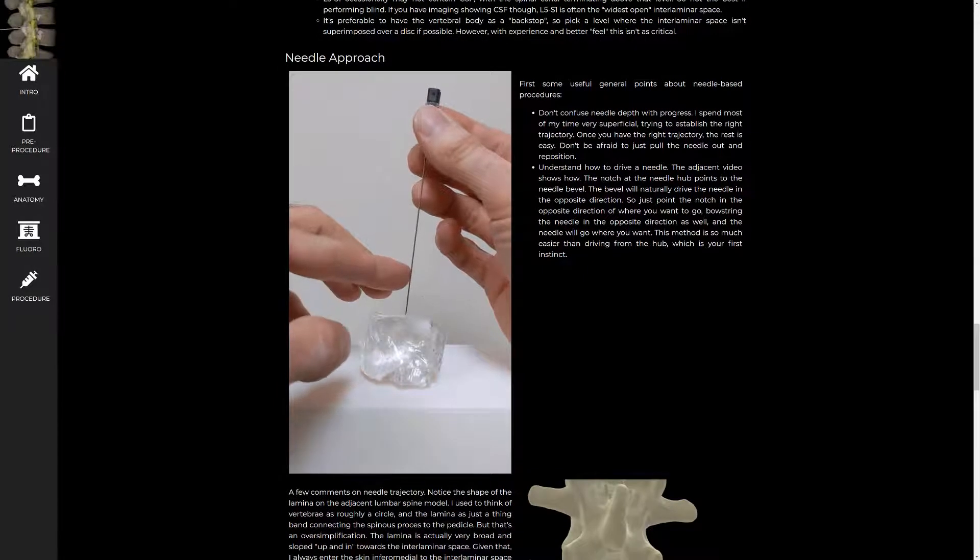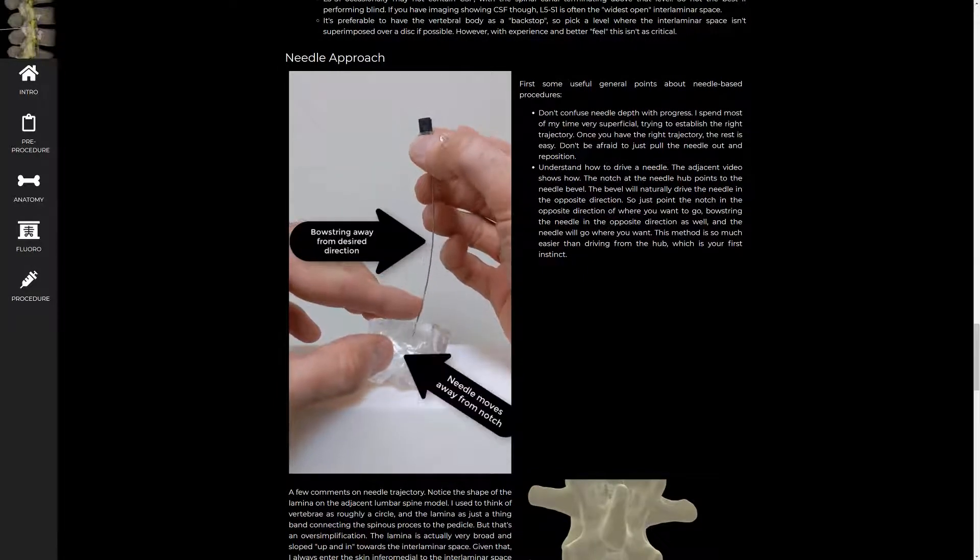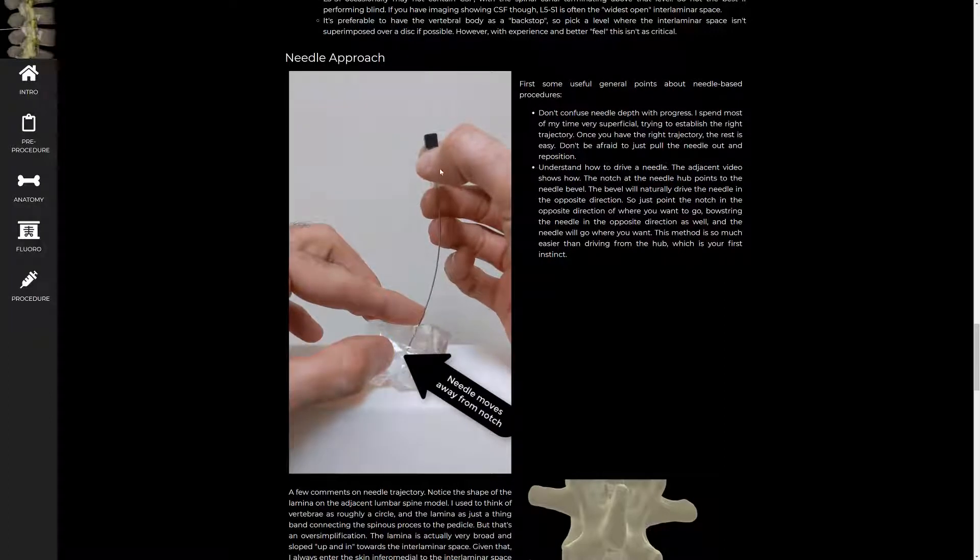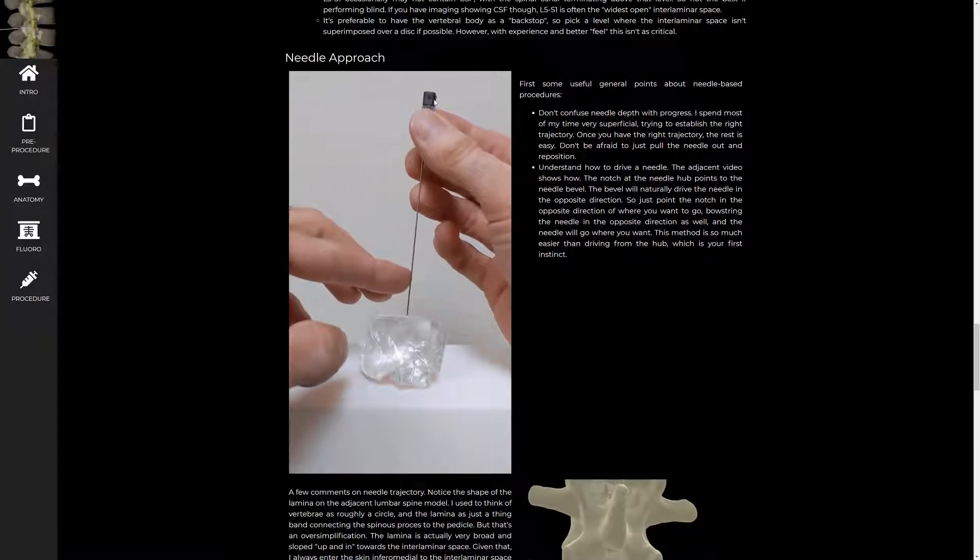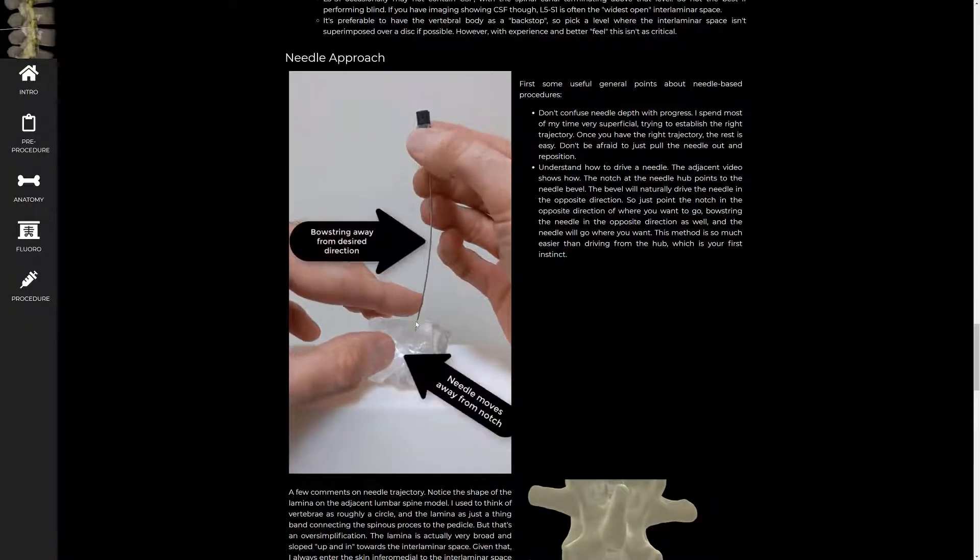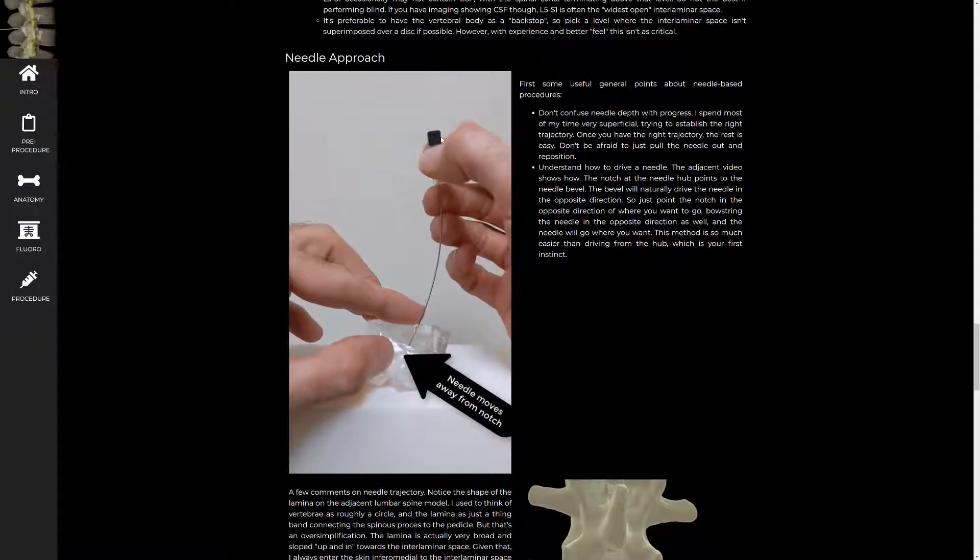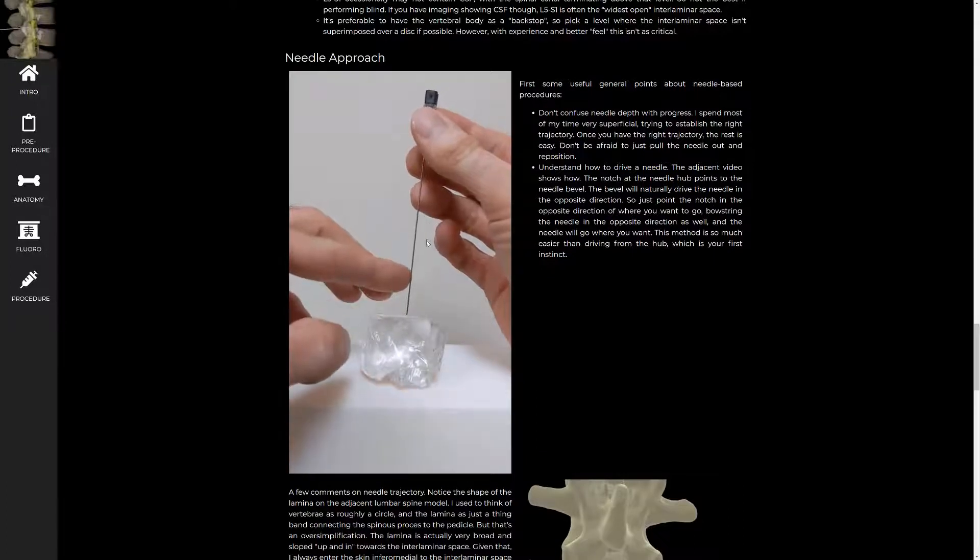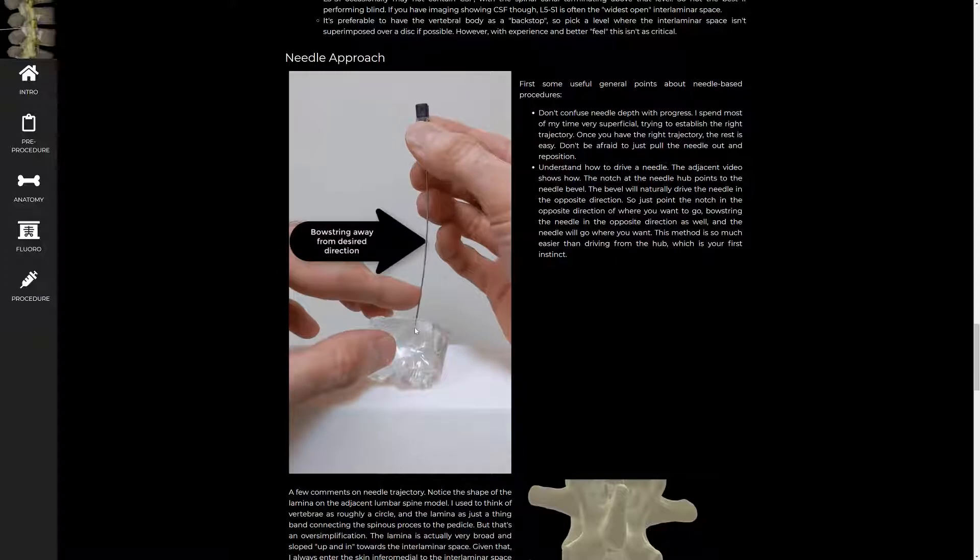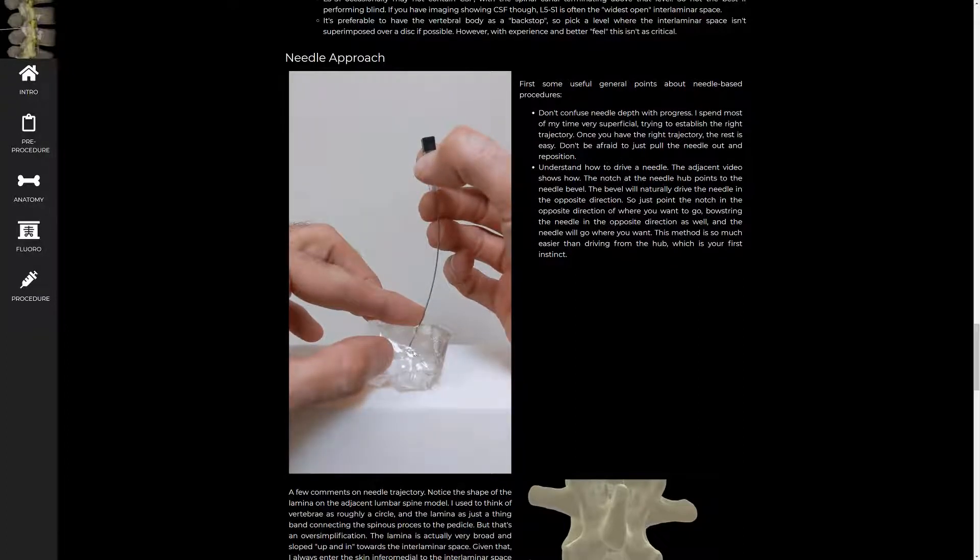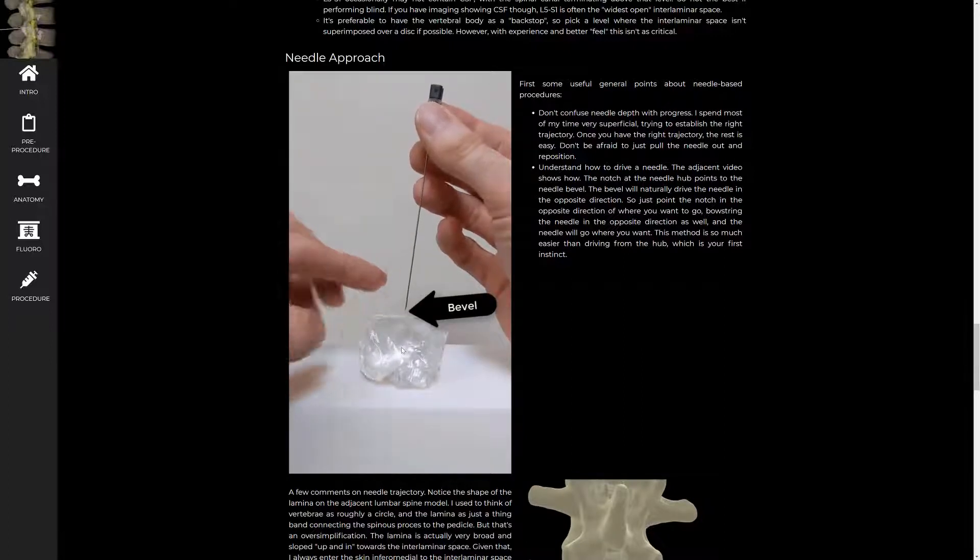So then I want to make a couple points about needle approach and driving a needle as well. If you look at the structure of your typical spinal needle, you have a notch in the hub that points the same direction as the bevel below. And so generally, you point your notch away from where you want the needle to go. And then you bowstring the needle away from where you want to go as well. And you can see that that drives the needle tip in the direction you want to go. So the notch is pointed to the right. The needle goes to the left. And that's very fundamental.